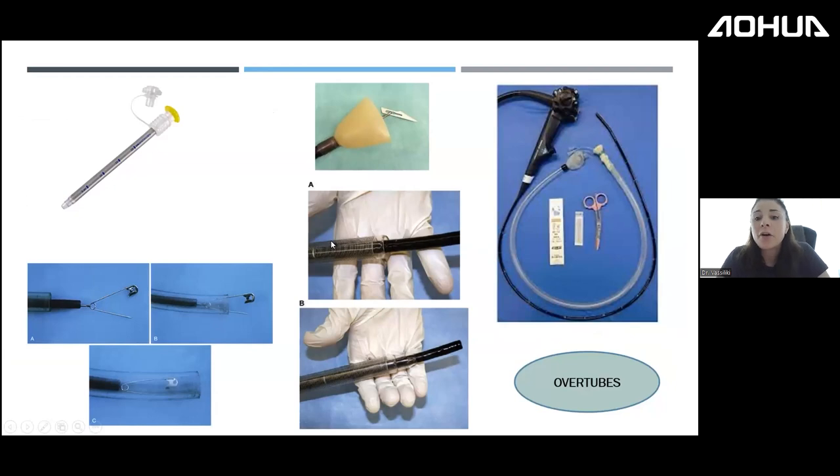Other accessories that help in endoscopic foreign body retrieval include the overtube. I tend to use overtubes a lot because they protect your endoscope, protect the esophagus, and protect against sharp objects like scissors or glass. There is also a protective cover for the endoscope, and this is how the pin fits into the overtube to protect both the patient and your endoscope from damage.